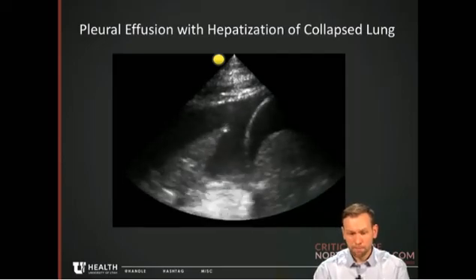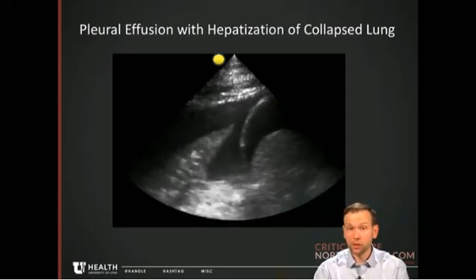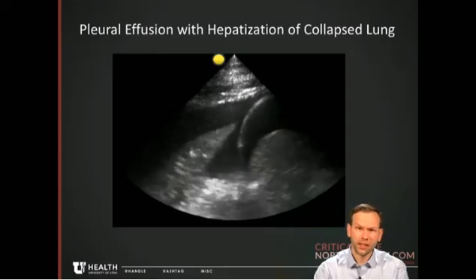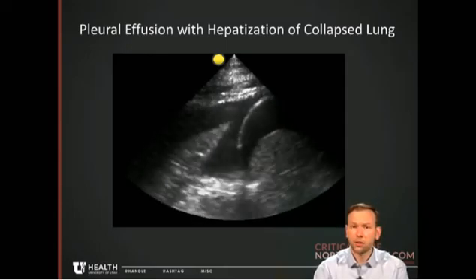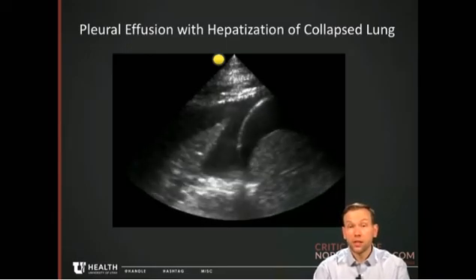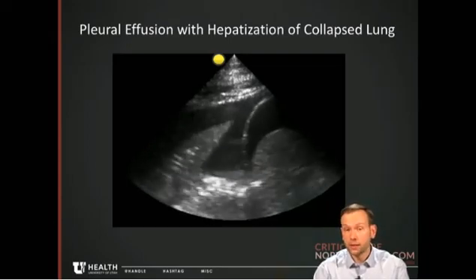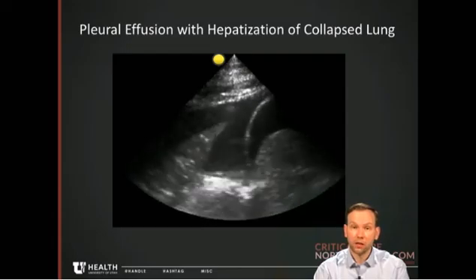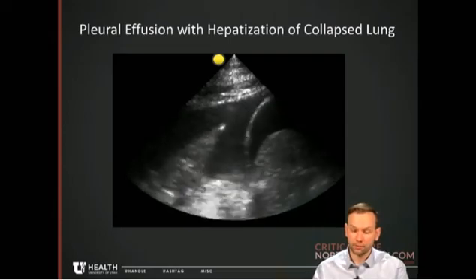Interestingly, it also appears that there's some fluid between the liver and the diaphragm. Typically, in a normal case, the diaphragm sits directly on the liver, and you don't see that extra fluid. So this image shows a few different findings that are also interesting and certainly part of lung ultrasound. This could be important for us if there's a hemopneumothorax that develops after a central line or with a trauma patient, so you can screen for pleural effusion in addition to screening for pneumothorax.